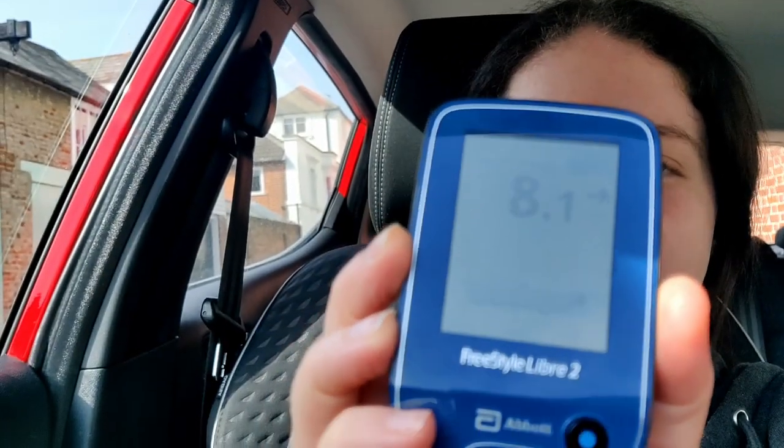It's lunchtime — I'm in the car because I went out to get some food. Quick blood sugar check: Freestyle Libre 1 says 8.1 straight across, and Freestyle Libre 2 says exactly the same: 8.1 straight across. They were literally identical — really good for accuracy.